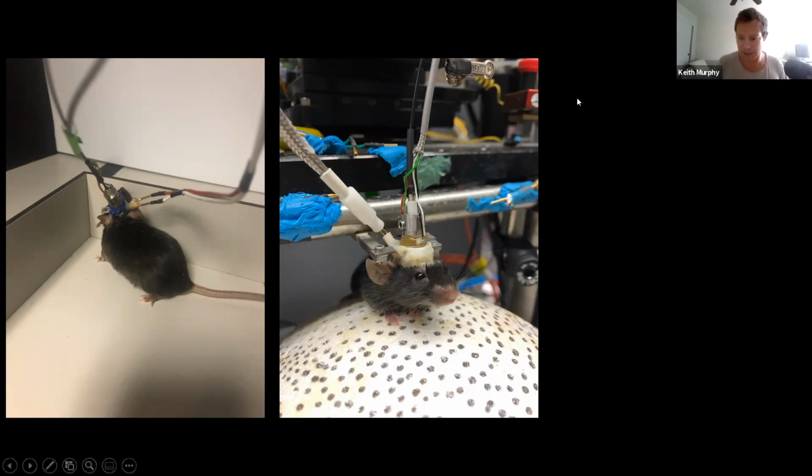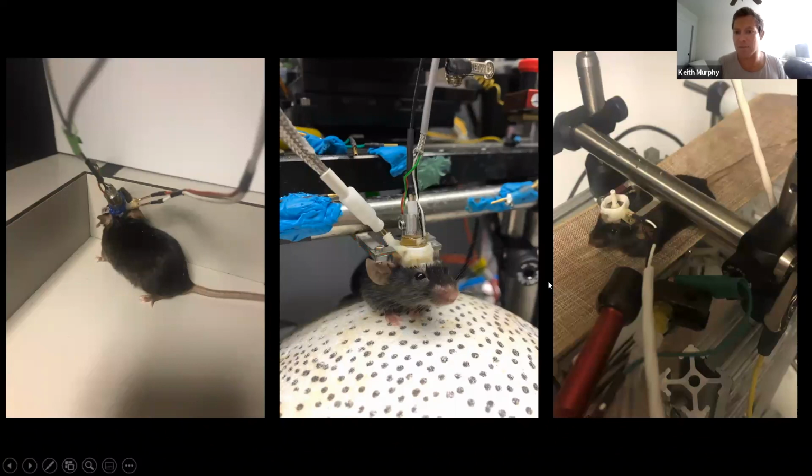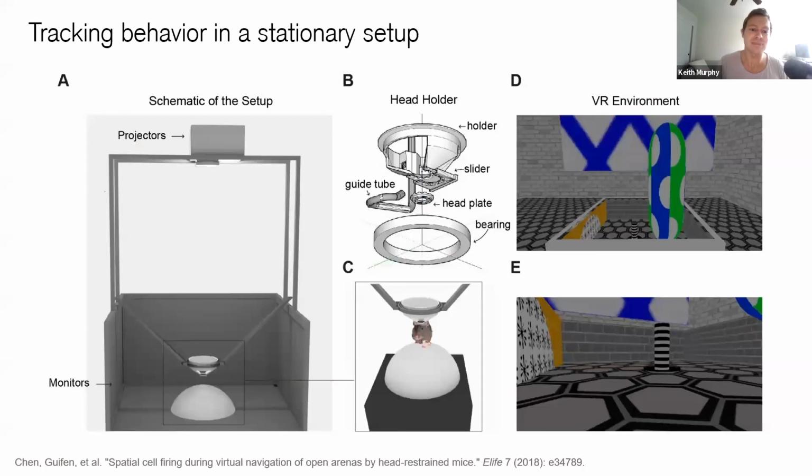And sorry, just quick on the screen here. Another way to allow the animal to move is to put a ribbon or a treadmill underneath them. So here you can see I'm using a standard Christmas ribbon, even though it's not festive colors. It is a ribbon, and that will freely move under the animal so it can run forwards or back up. Same principle at play here.